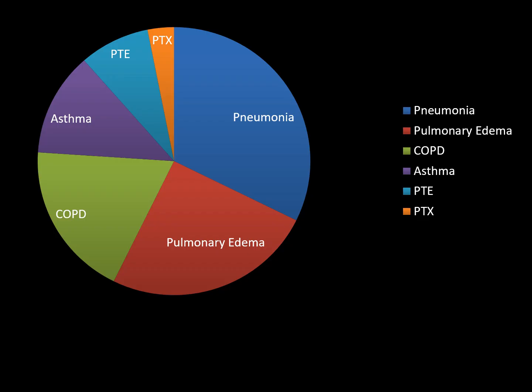The protocol correctly diagnosed the cause of acute severe dyspnea with greater than 90% accuracy in a population of 260 patients with this distribution of disease in the absence of any clinical data. To finish up the talk, we'll quickly go through 4 cases.